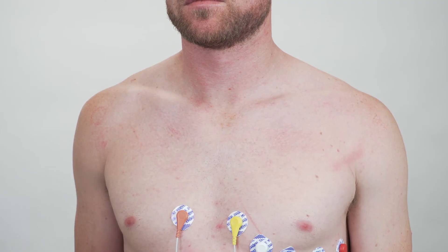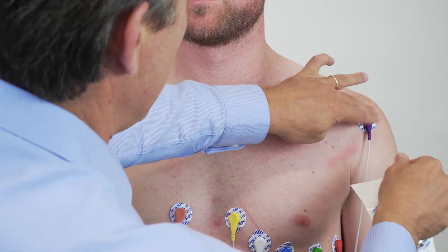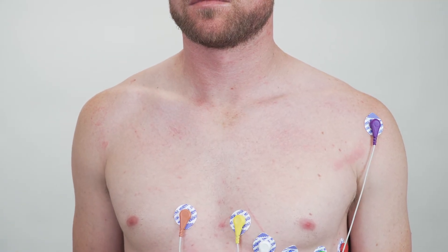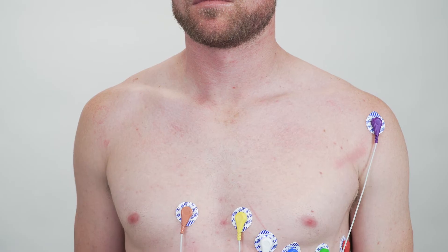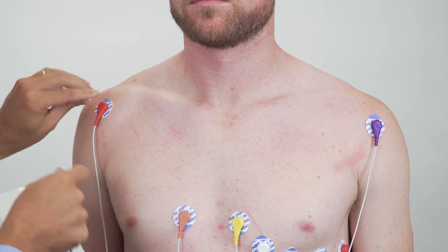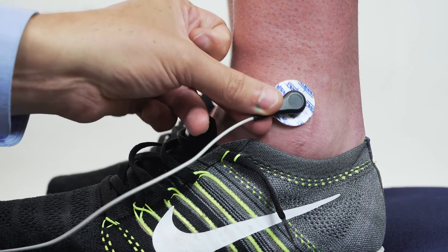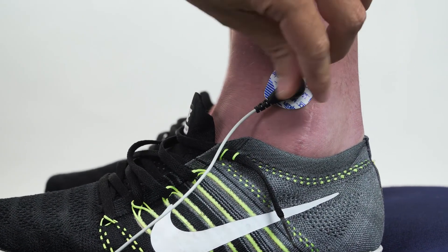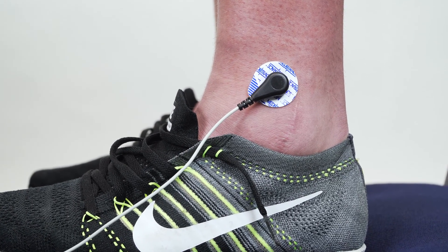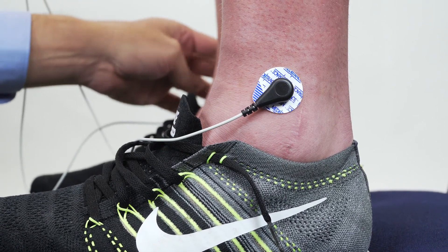Now we're going to stick on the limb leads, lead one and lead two. First we're going to stick on the left arm, and try to stick it on somewhere where there is not a lot of muscle movement because that will just cause EMG. Put on the right arm, and then we can connect the left leg which is the reference for all the augmented leads. Lastly we can stick on the common which goes to the ground input on the octal bioamp — stick that on the right leg.